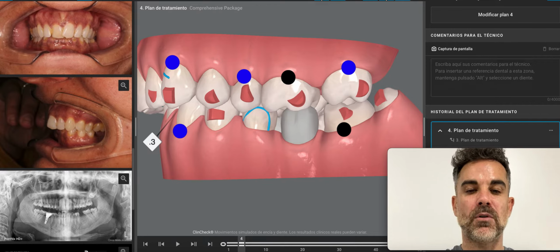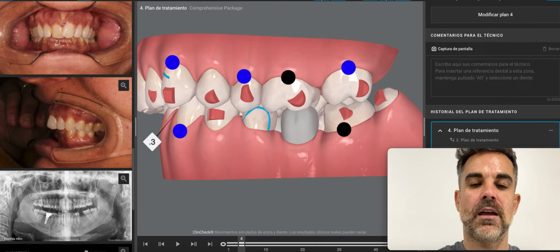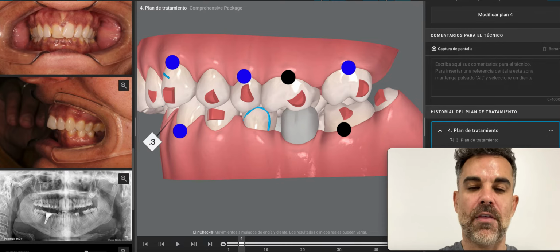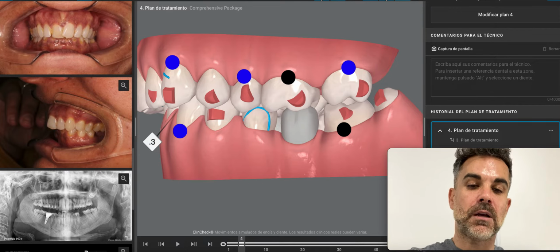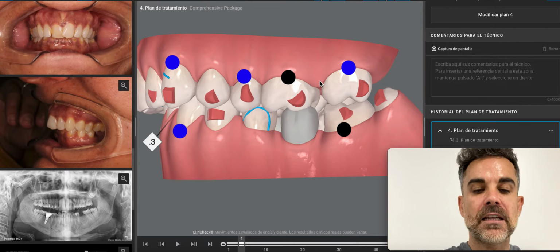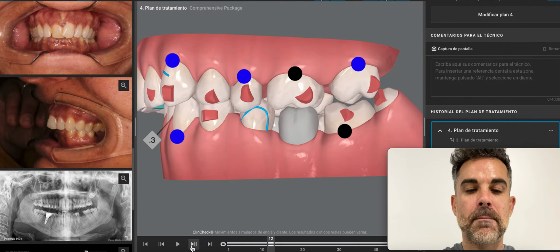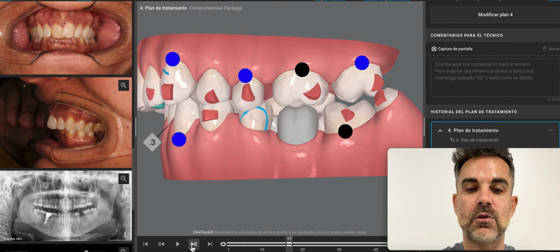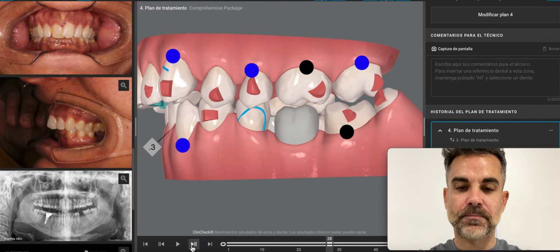We're going to place a pontic in between, and this pontic with some space, mesial and distal, will give us some extra control of the surfaces adjacent to the space. With the elastic, we're going to create 2 effects. We're going to help mesialize the third quadrant, which has been distalized because of the absence of the 6. So the class 2 vector will help us create this mesialization of the arch during the treatment, as well as helping us with the distalization of the upper arch.